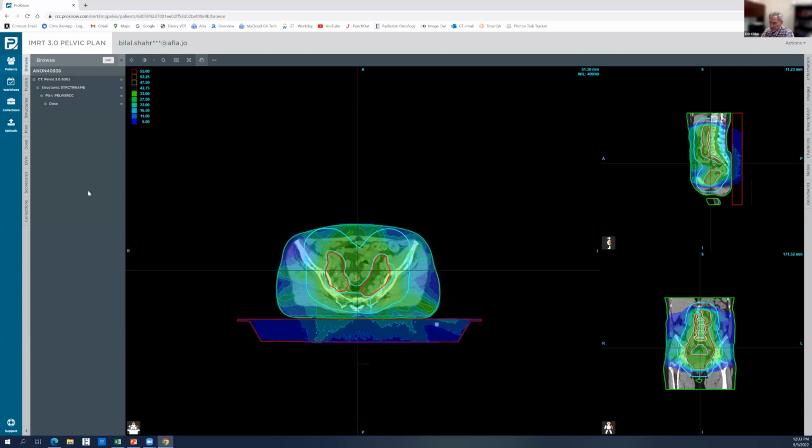We did go back, and there are some tools in here. We did check the Hounsfield units on your couch, and it looks normal. So I just don't know why the dose showed up in there. And remember, dose is the energy over the mass, and this is a low mass area, so you're dividing by a very small number. If you look at plans, you'll see dose in areas, but normally we don't display that. But it's showing up, and it is what it is. Sorry, Eric, there was a comment in there that said it is normal in Monaco. There were several Monaco plans submitted and we didn't see it, so it still was a little odd. It's not to say anything's necessarily wrong, but it was just an observation that was odd or unusual.